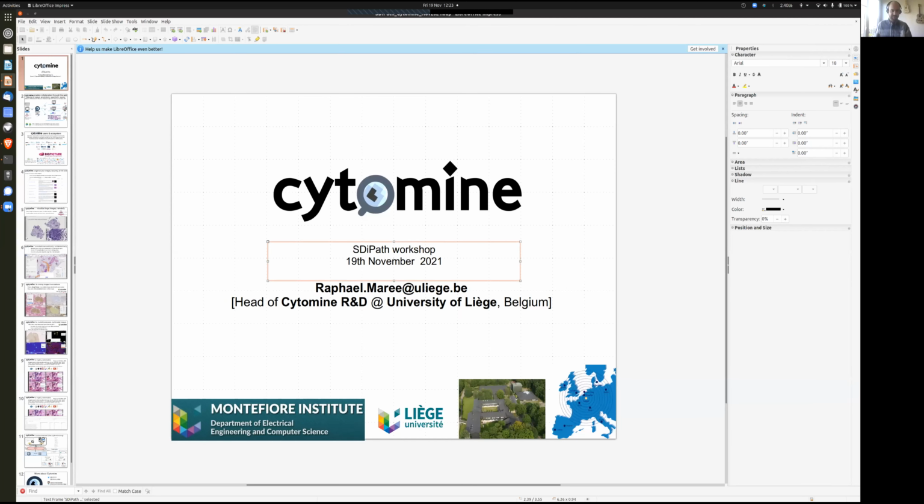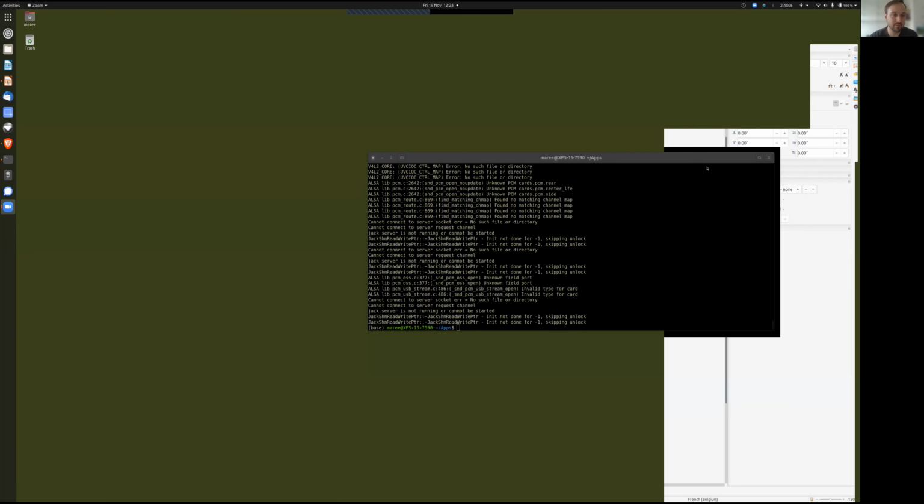You're still on mute, Cedric. Yeah, I just realized. Thank you very much for this interesting talk. We have a couple of questions. The first one is, which image reader is used to visualize the images?